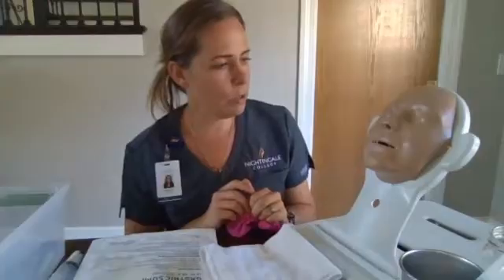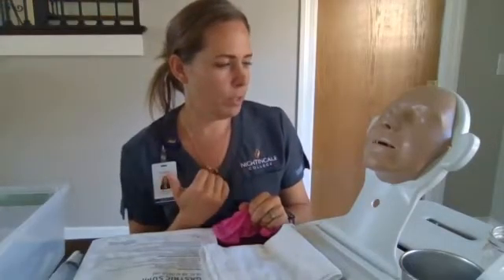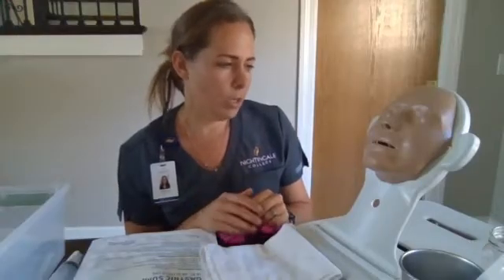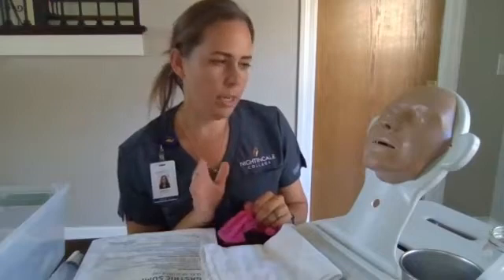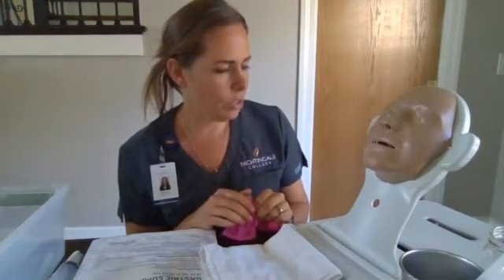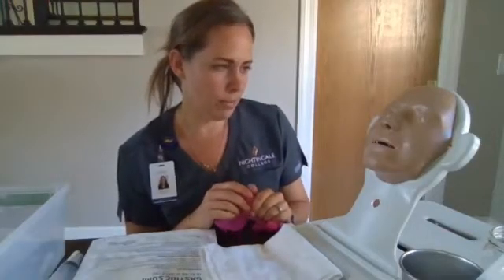Mr. Smith, today your doctor has ordered the placement of an NG tube, which is a tube that goes from your nose into your stomach. This tube is going to be hooked up to low continuous suction, and it's just going to clear out your stomach and make sure that there's no stomach contents, to give your bowels some time to heal.